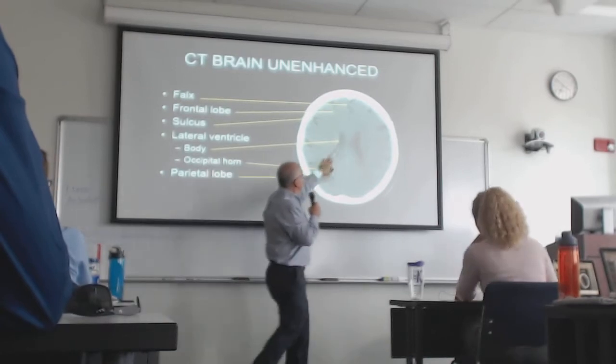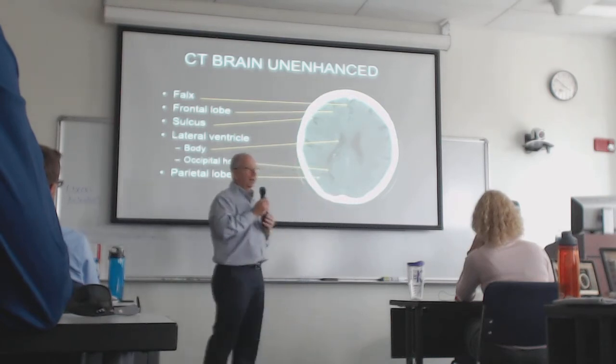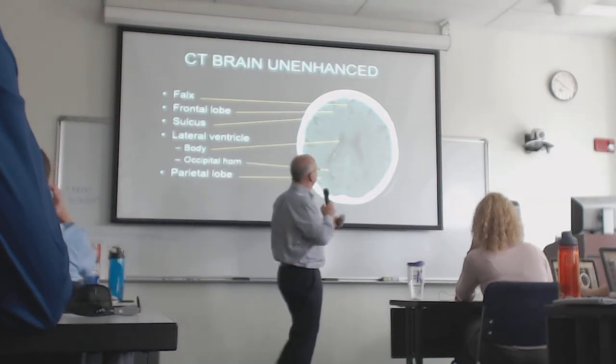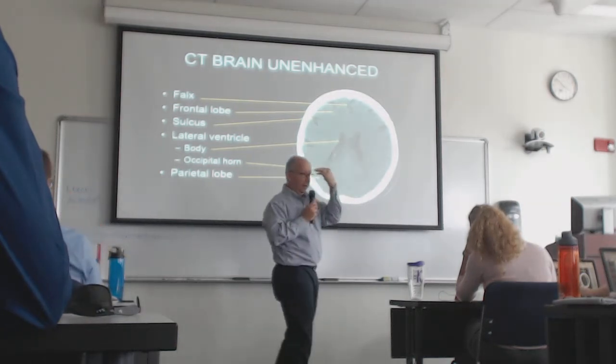A little higher still. Now you're into the bodies of the lateral ventricles. There's the midline falx. Very important for me, that midline falx, because if I think that there's something pushing on one side or the other, I'll take my electronic cursor and draw a line from there to there, which is the middle of the skull on either side.